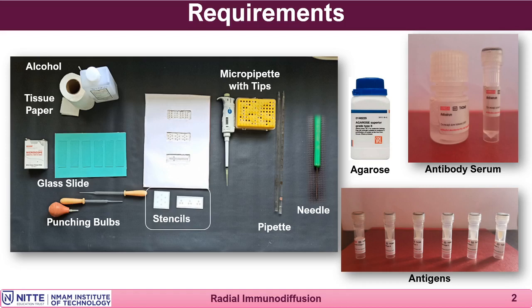And this punch is used for punching the wells on the agarose gel, and these wells are used for loading the antigen and the antibody.